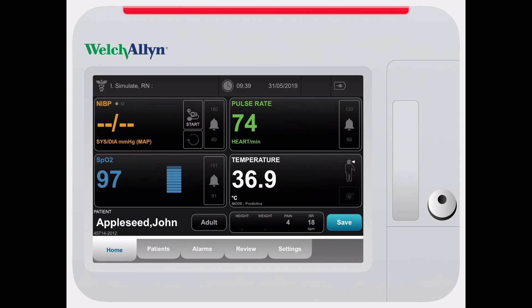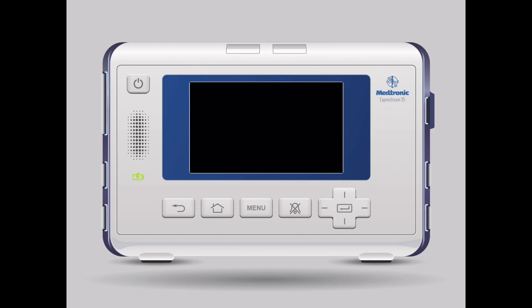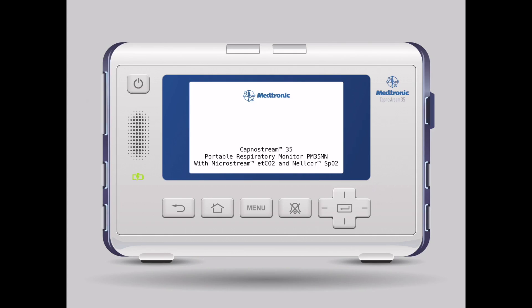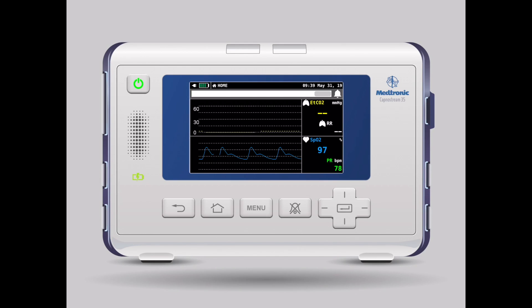We have the Welsh Allen Kinex Vital Signs monitor, which is a monitor typically used in a ward. And finally we have the Medtronic Capno stream, which is a monitor that measures end tidal CO2 and SPO2.